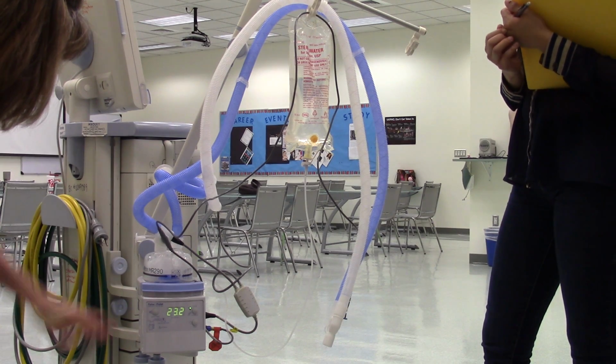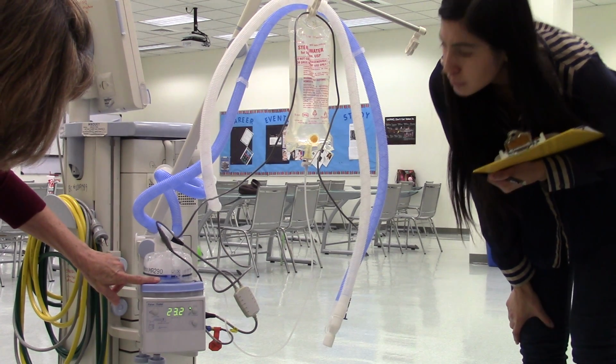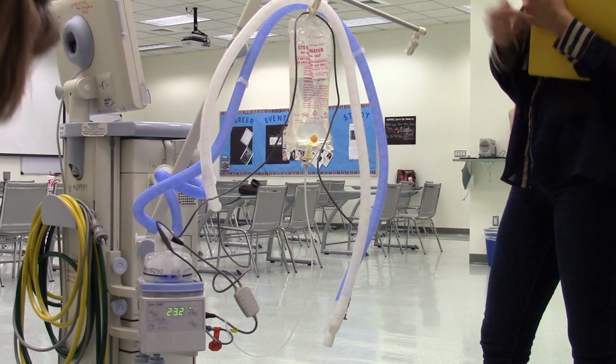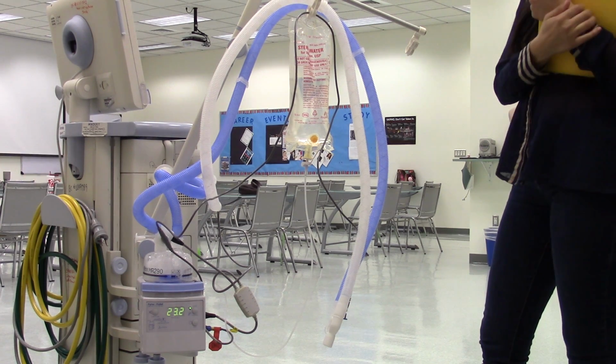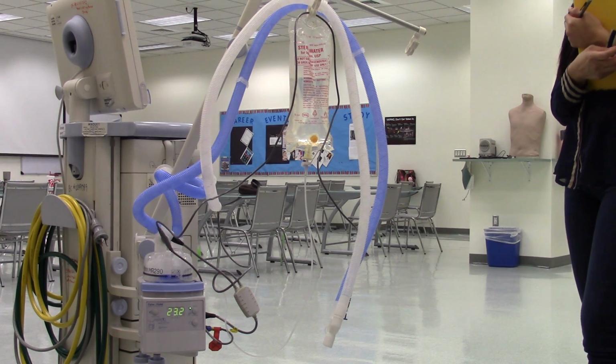Oh, okay. And you want to know what the temperature is inside the chamber? Well, no, I just wanted to know what the readout is telling us. It's telling us at the patient. It's telling you at the patient? Okay, so you would want it to be at 39 on there?